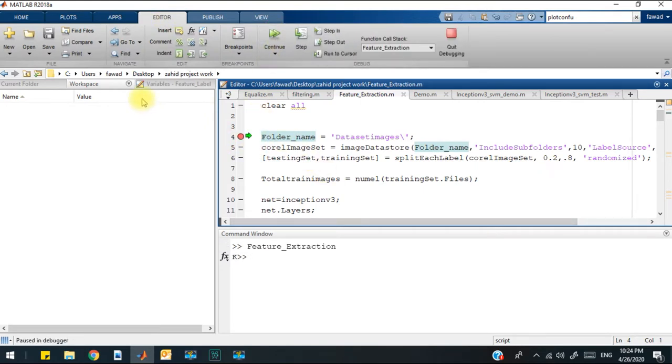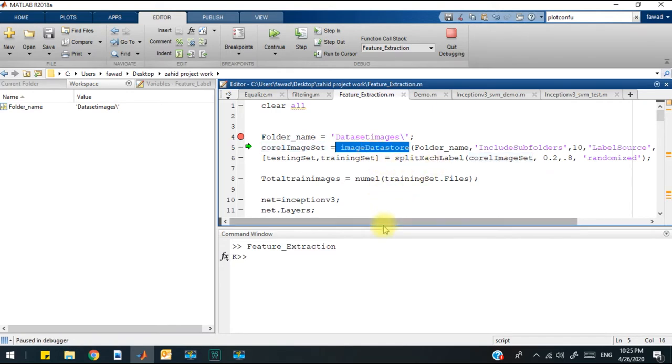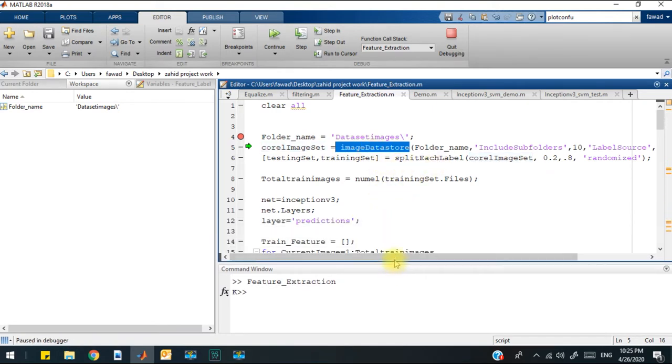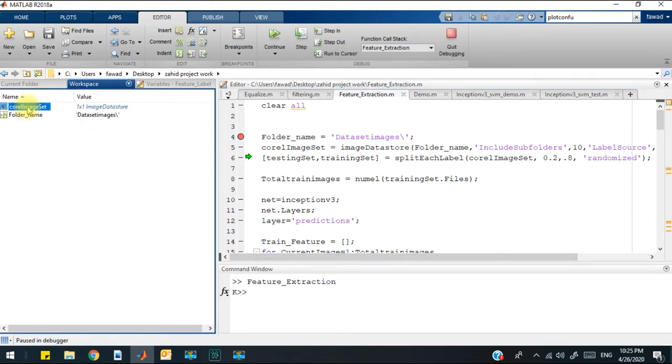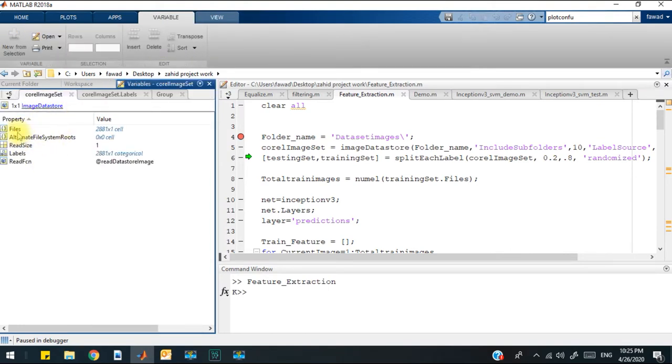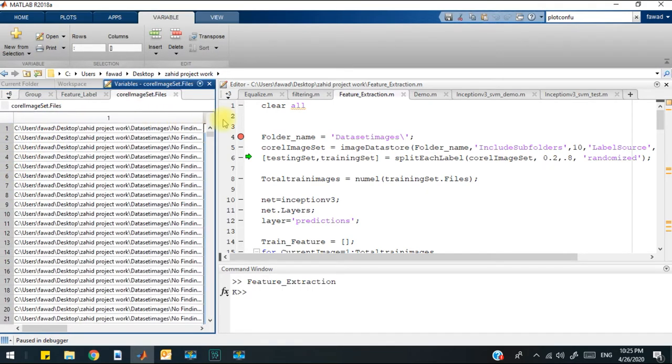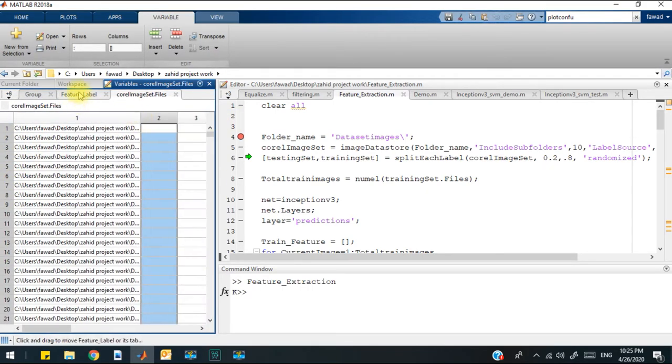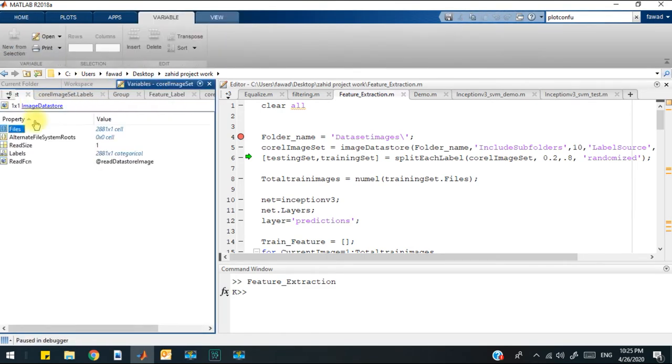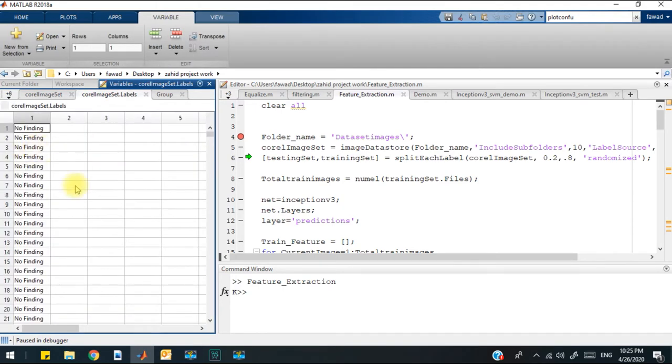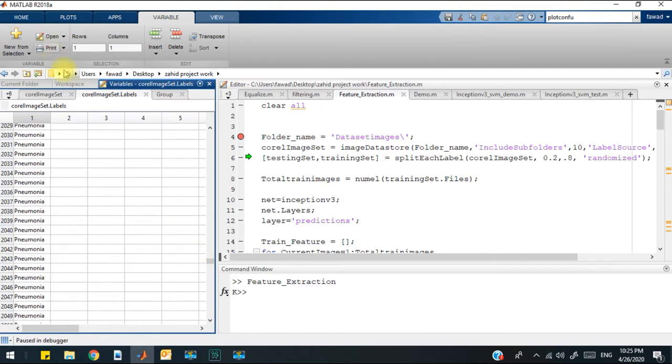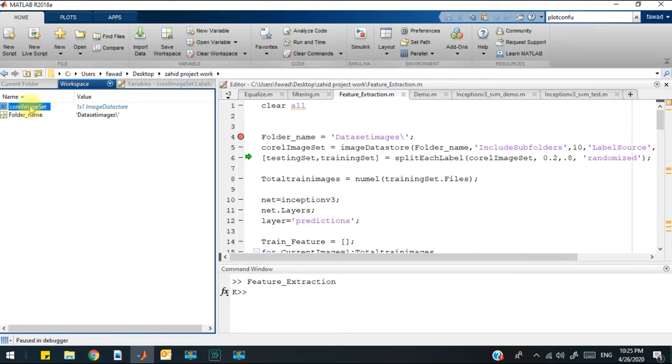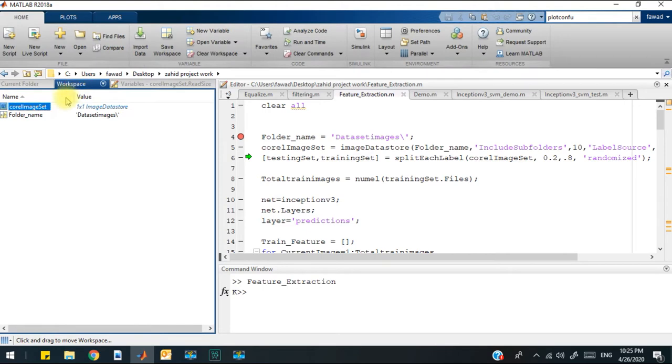If I run this code line by line, you will see what happened in the workspace. The second line shows that the image data store—I have used that because the folder contains some images. That data store will create a structure within the workspace. You will see that in the workspace I have got a structure. If I open this structure, you will see that there are files—the name of the files within the folder. These are the names and complete addresses of each folder. The second thing which is very important is the labels. You can see that there are different various labels: pneumonia and normal.